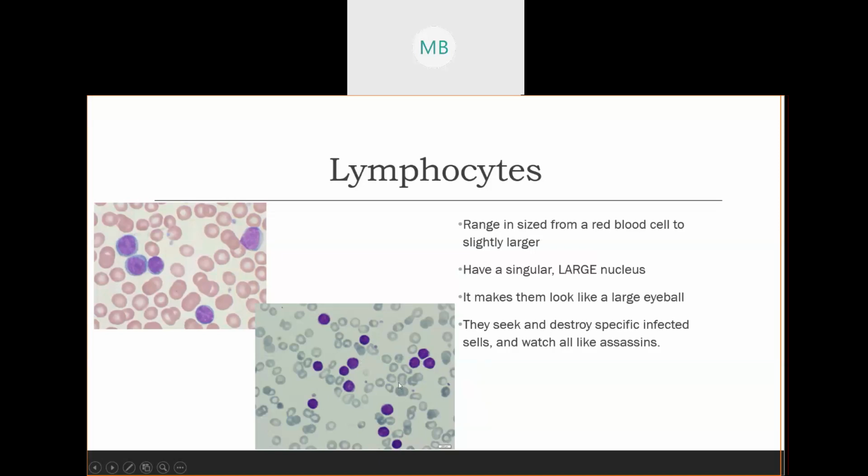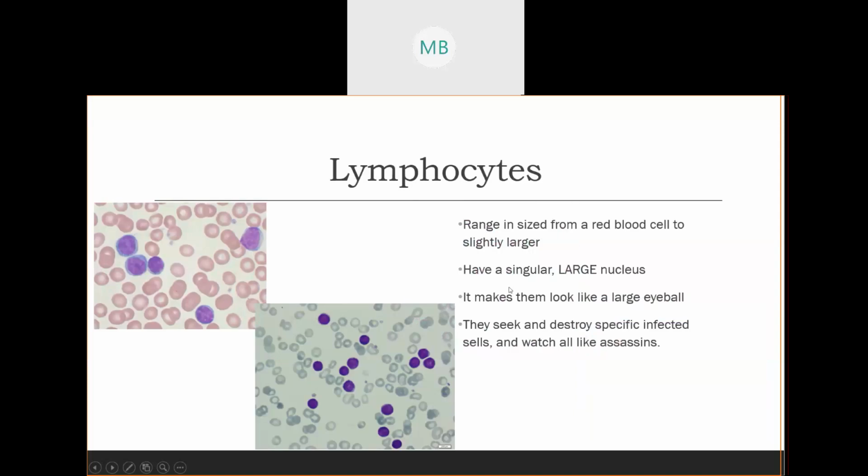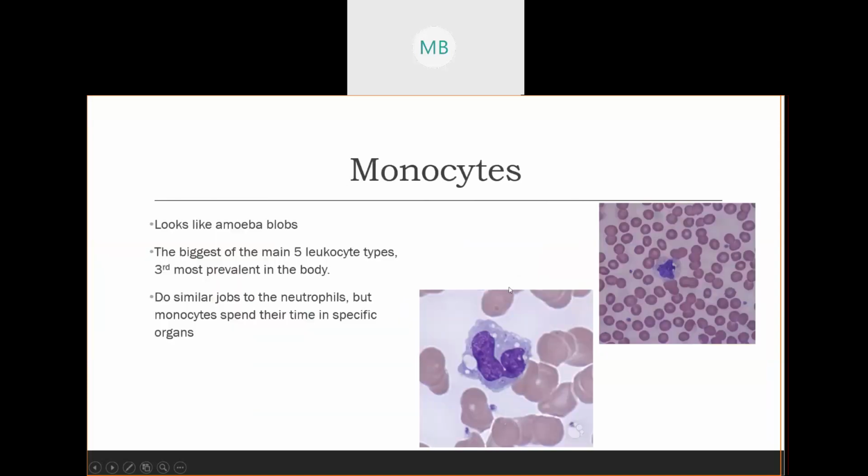We've seen some lymphocytes in previous ones. Like on this eosinophil slide, you see 3 eosinophils here, and then 1 lone lymphocyte in the corner. I encourage you guys to go back through and just Google pictures of blood slides and see what you can pick up and label. And once again, eosinophil, your erythrocytes are your red blood cells, and then you have some platelets here. Just look through Google and Bing images and see what you can find and label, because you guys can do it. Just compare things.